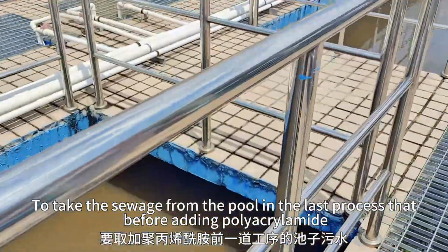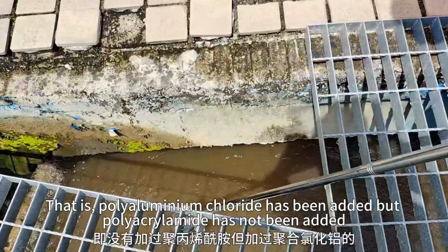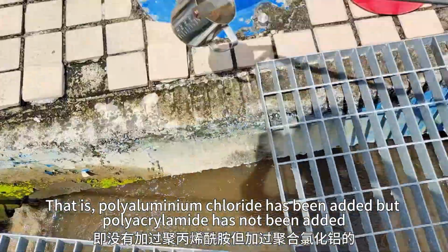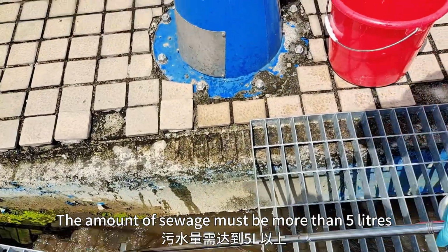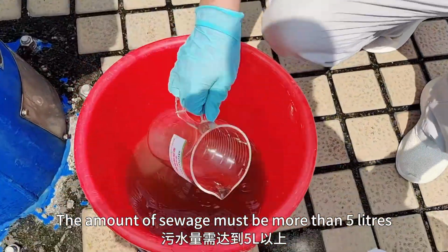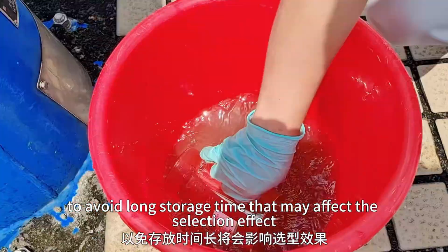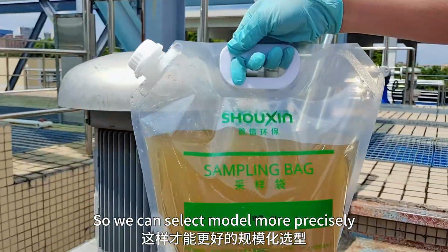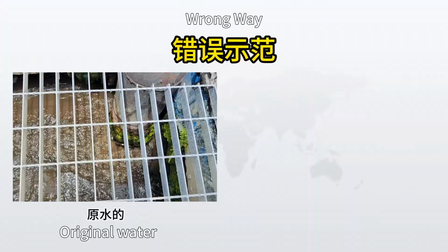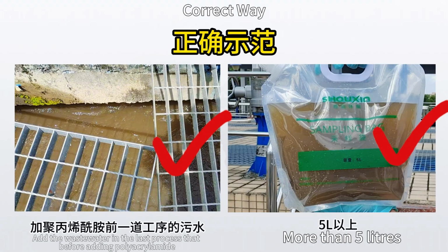We should take the sewage from the pool in the last process before adding polyacrylamide, that is, where polyaluminum chloride has been added but polyacrylamide has not been added. The amount of sewage must be more than 5 liters. The collected sewage needs to be sent out as soon as possible to avoid long storage time that may affect the selection effect, so we can select the model more precisely. The above are the precautions and the correct demonstrations for sewage sampling.